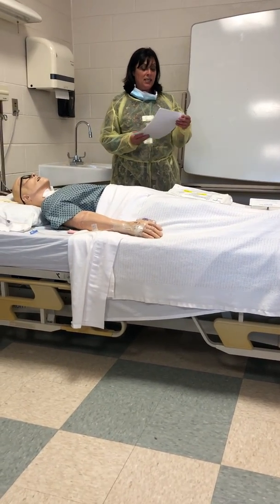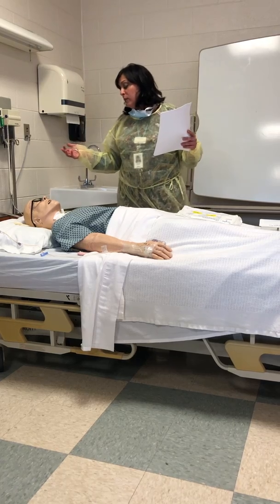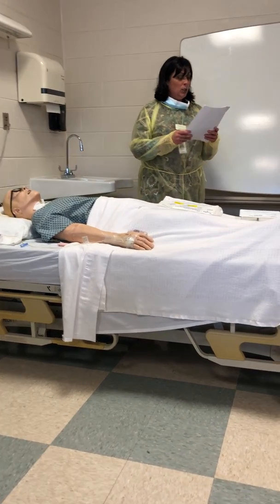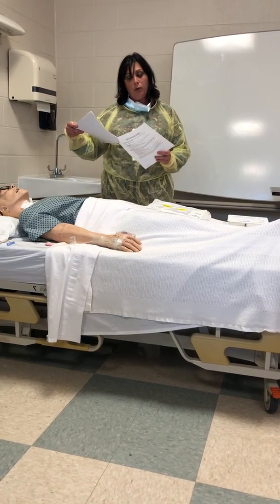Principles. The biggest things, obviously, we have to verify our order, verify our patient, and tell the patient what we're doing and why we're doing it. We're doing this to maintain your airway and prevent infection there, Mr. Clark. You should already have gathered all your supplies.